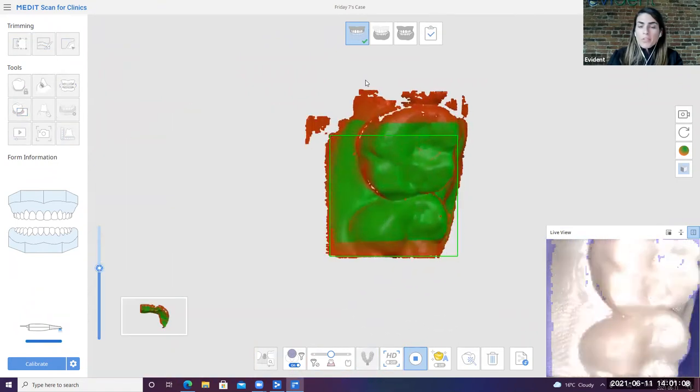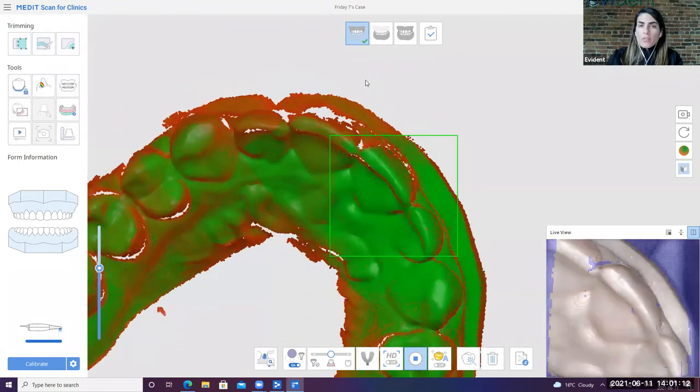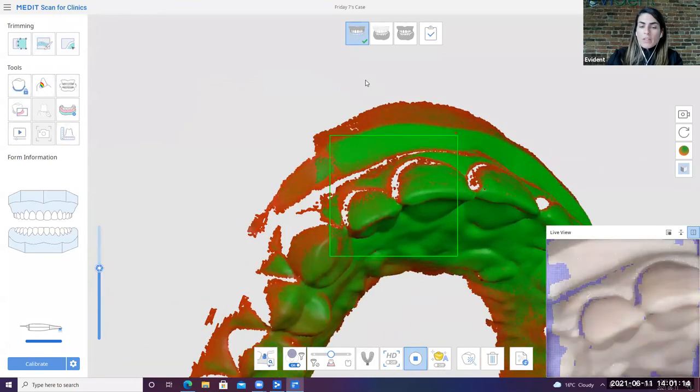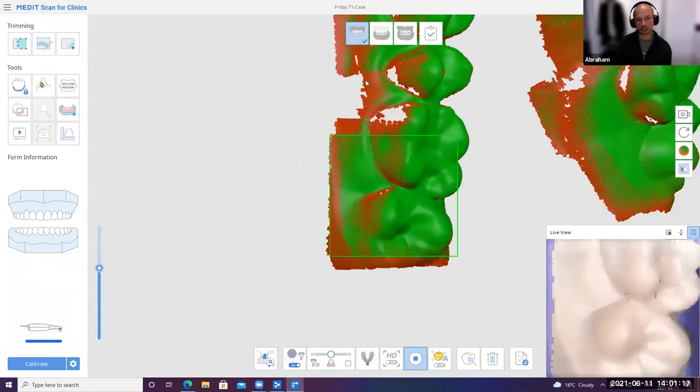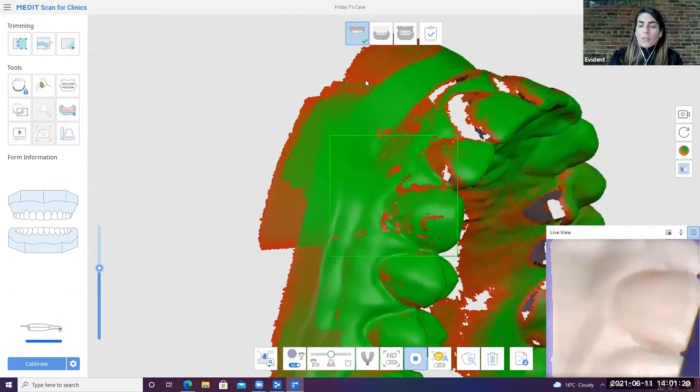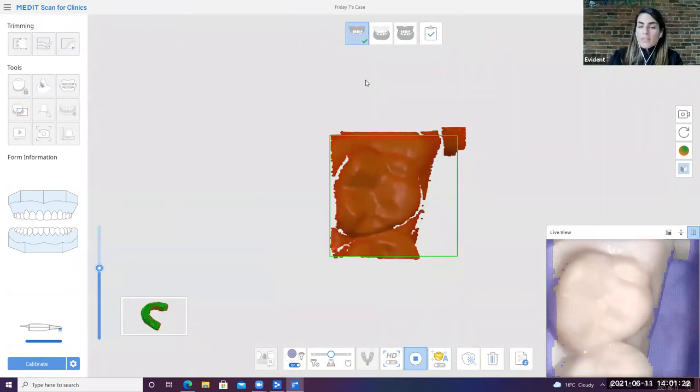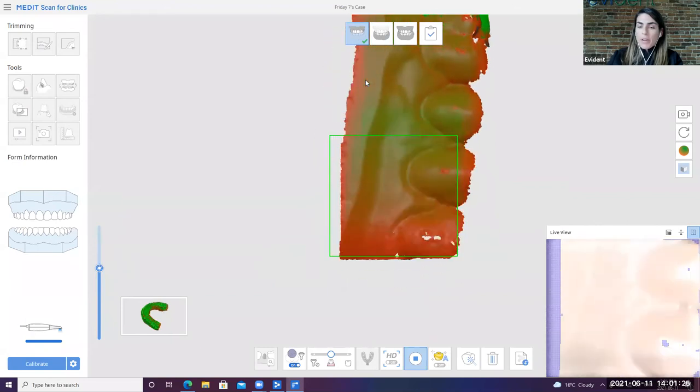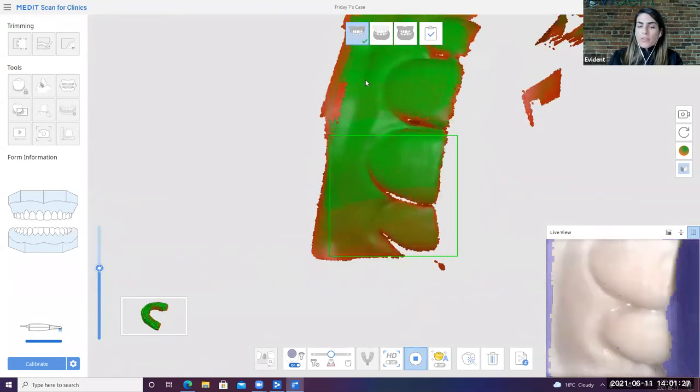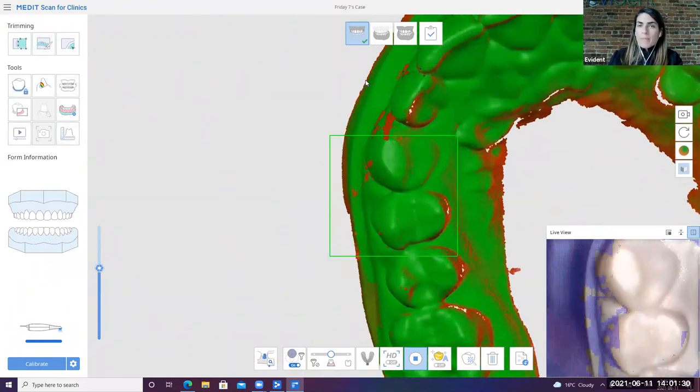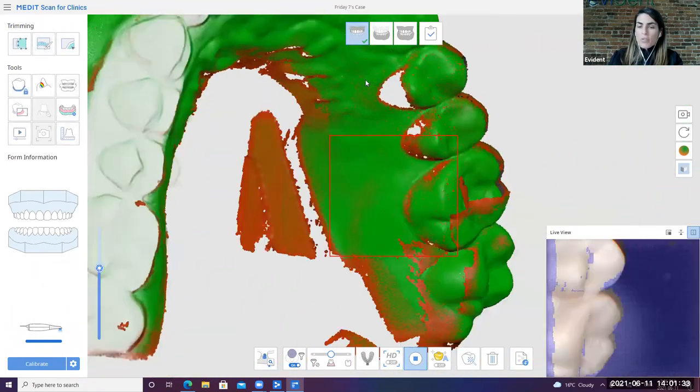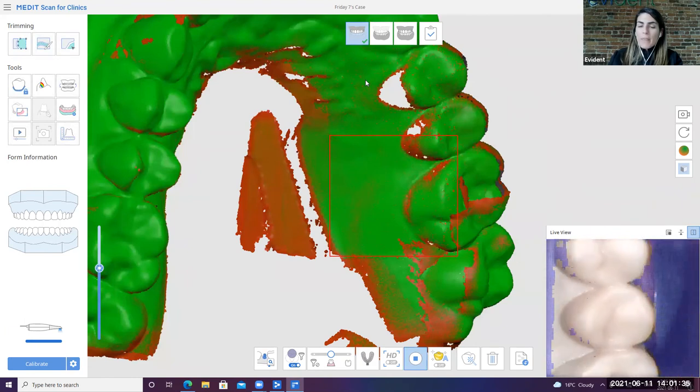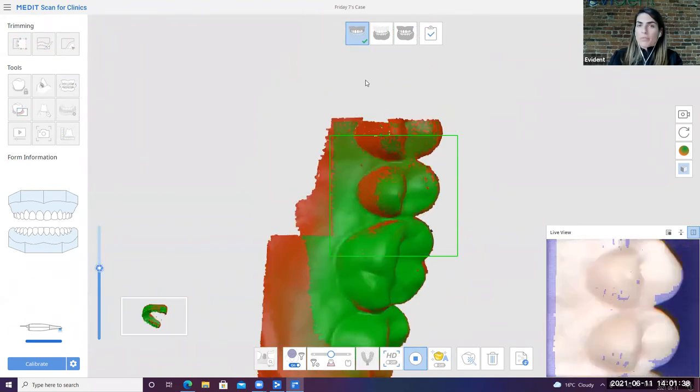So you'll see that the Medit also has a smart stitch feature. So for example, you will have noticed on the left-hand side of the screen that there's some data that gets picked up. So when you're scanning, it gives you the ability to be a bit more flexible in your scan pattern. And as you build your information, it actually pieces it all together and meshes it for you so that you can focus on trying to scan and capture the imagery and letting the post-processing do it on its own.